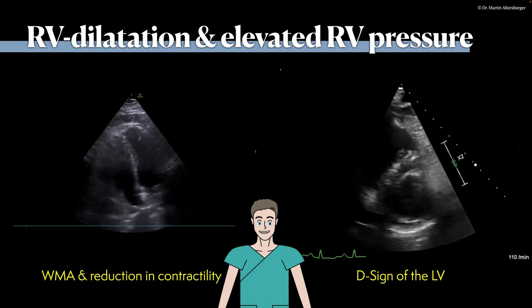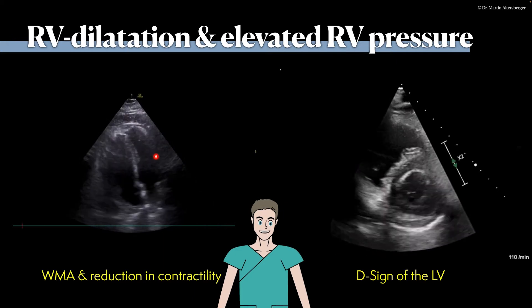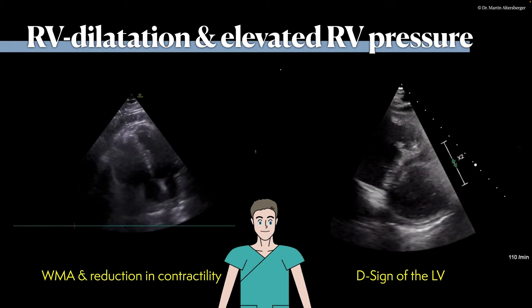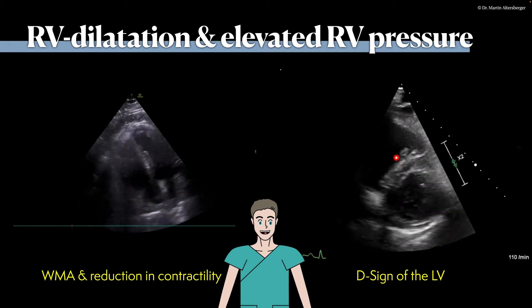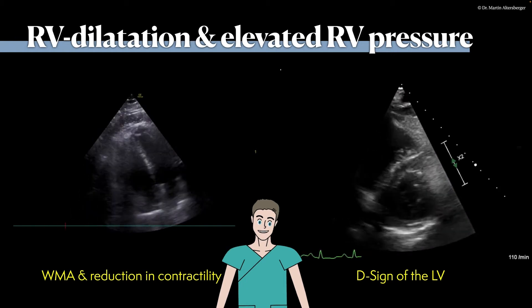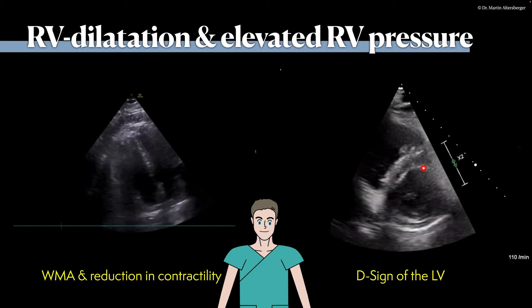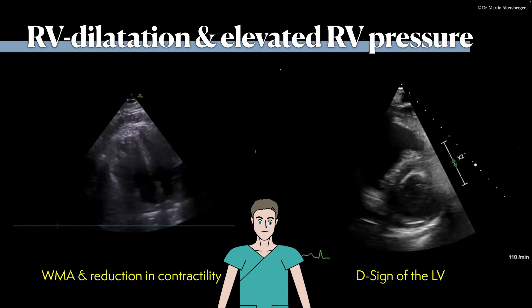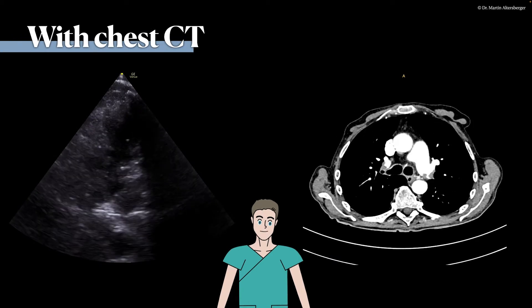We also see a D sign of the left ventricle, which you can appreciate in this view because the septum is pushed from the right side of the heart towards the left side. The pressure flattens the septum in this pressure overload caused by a central hemodynamically relevant pulmonary embolism, and the heart takes on a so-called D-shaped form — the left ventricle looks like the letter D.